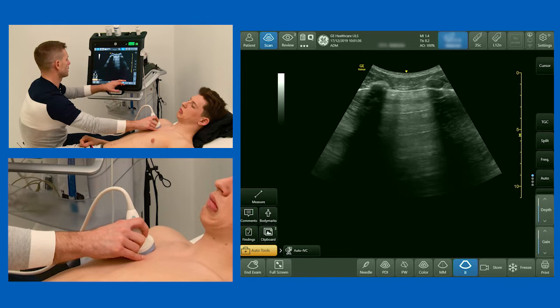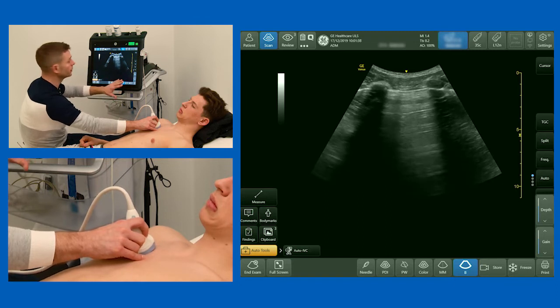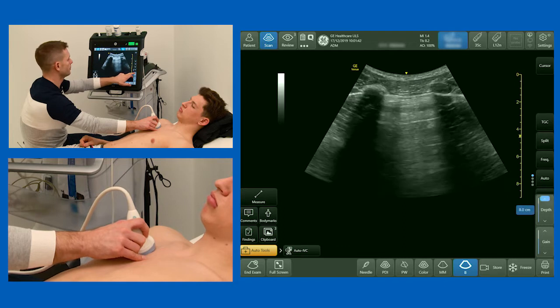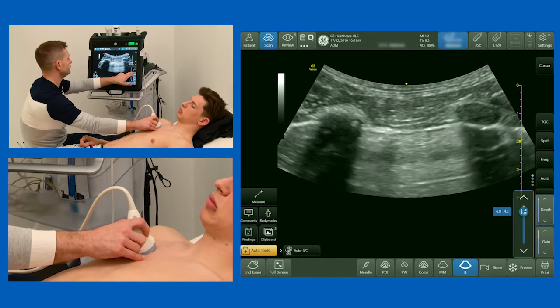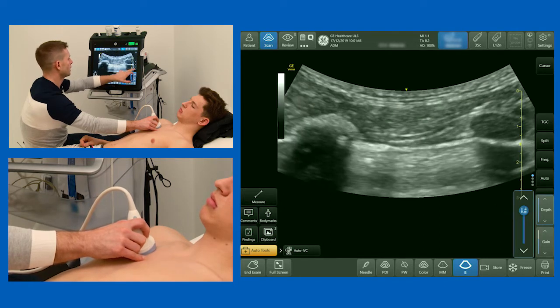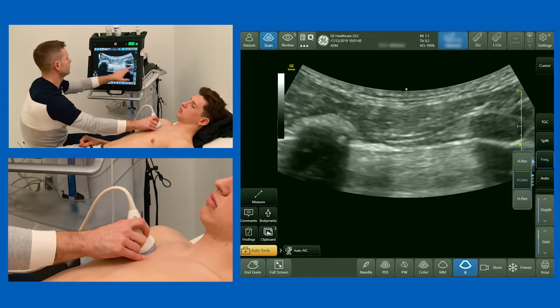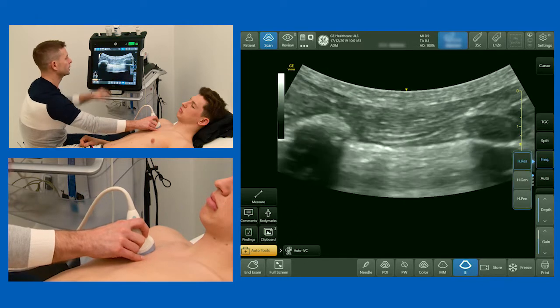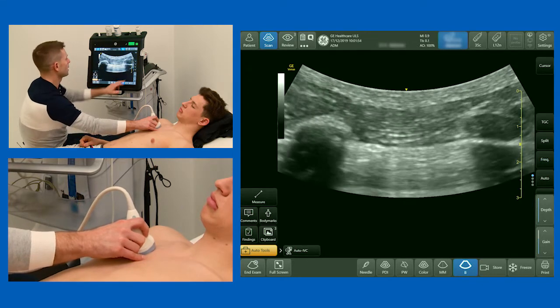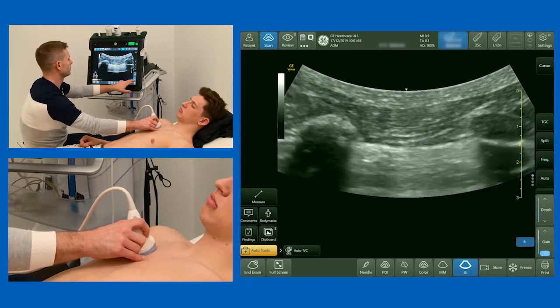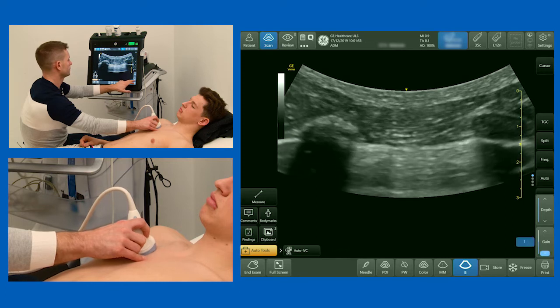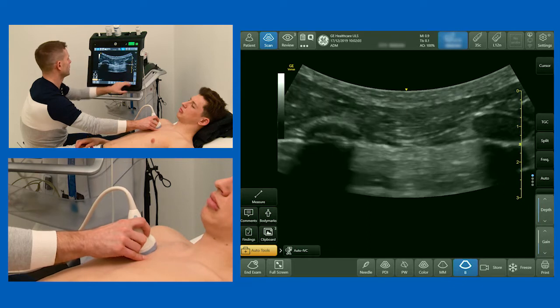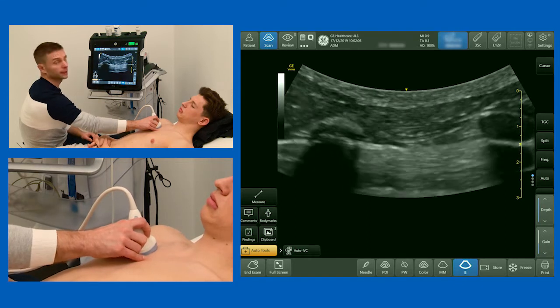Now to see this optimally, I want to make a few adjustments to my machine. I'm going to make the depth very shallow, put the frequency as high as possible because we're looking at something superficial, and turn the gain down. Having a shallow depth, a high frequency, and a low gain will make lung sliding easiest to see.